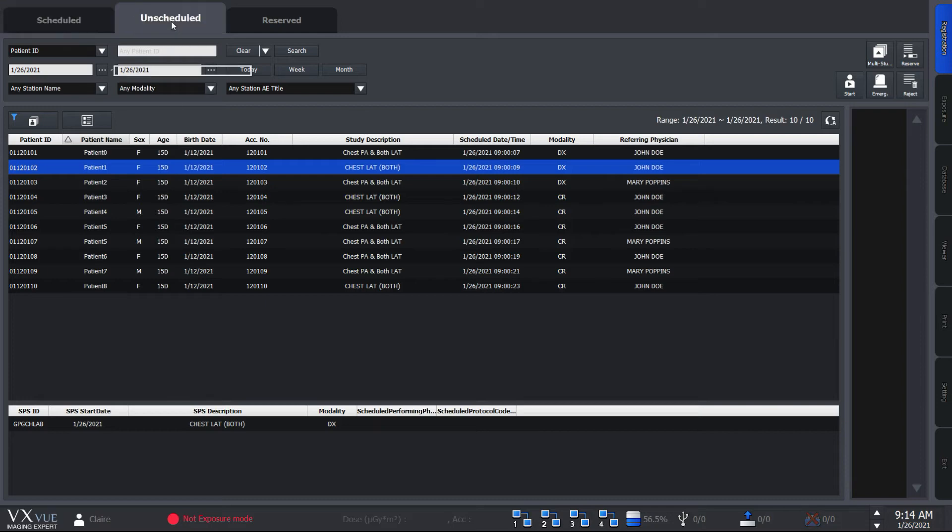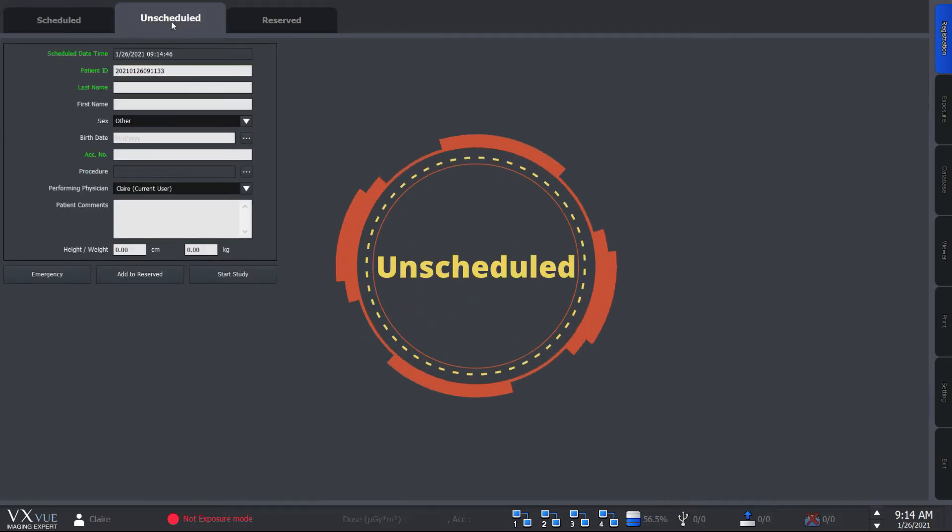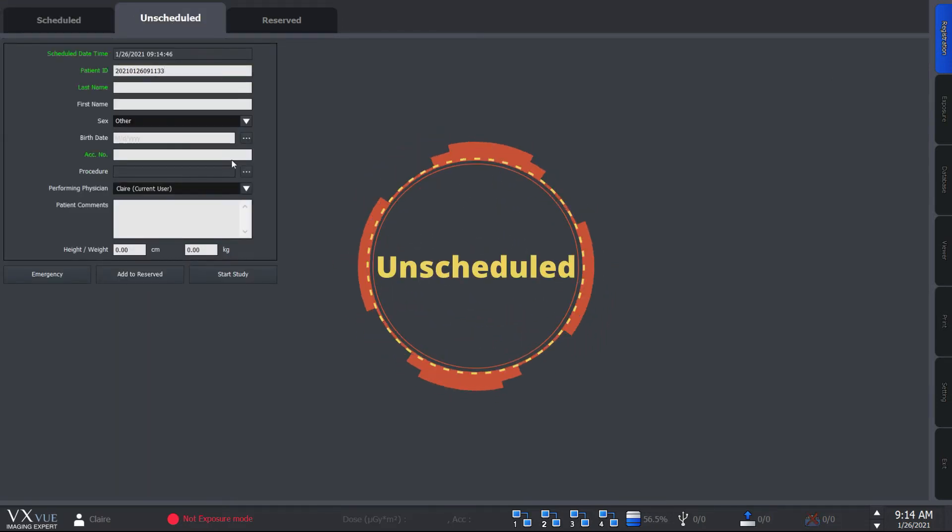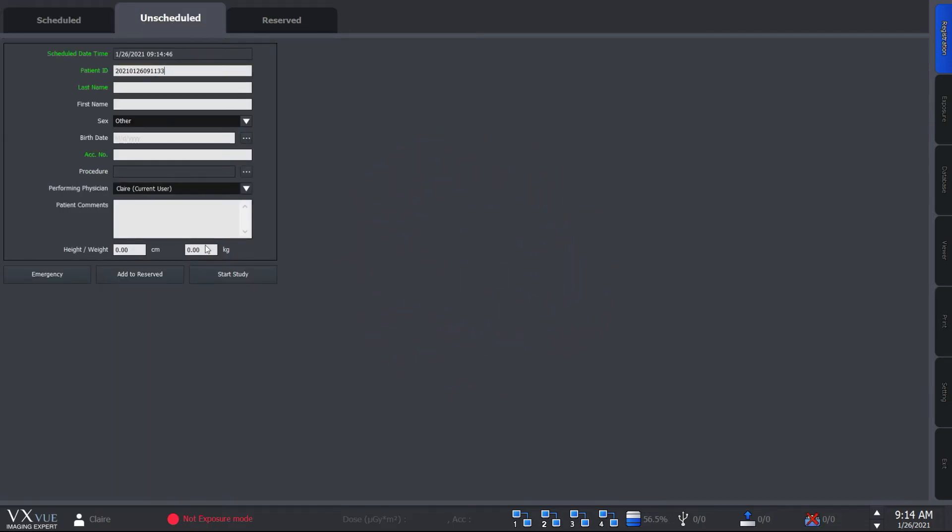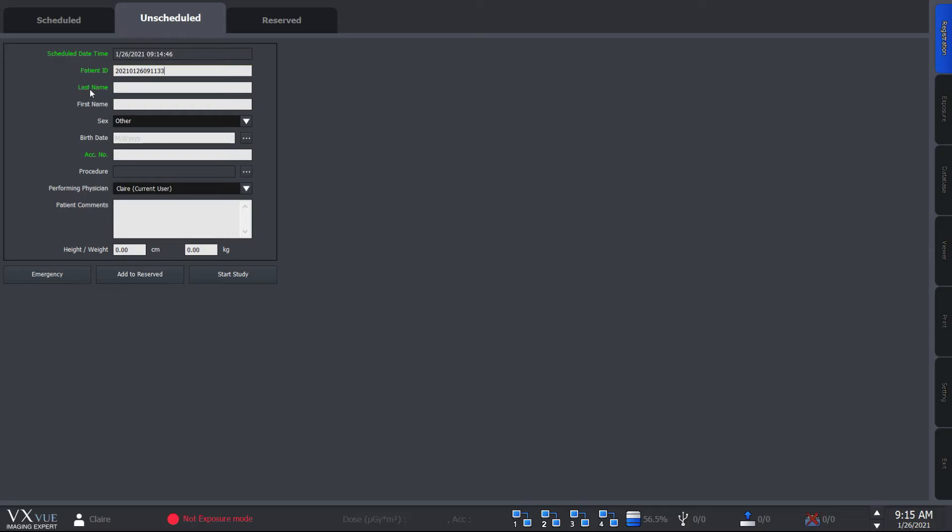Let's move on to the unscheduled panel. Now unscheduled panel is for those who don't use the work list or have a patient coming in unexpectedly. In this mode, you would have to manually fill in the patient information here. Now the green color indicates information that are required and of course you can change this in the setting mode.